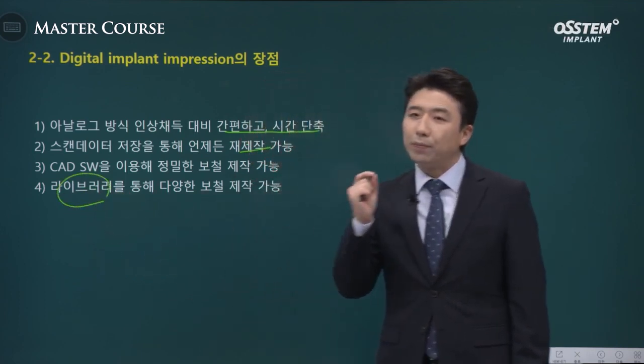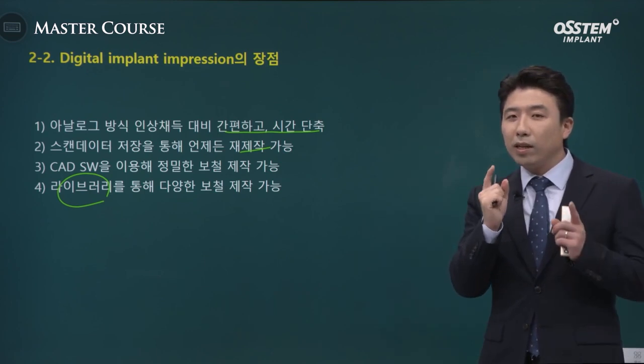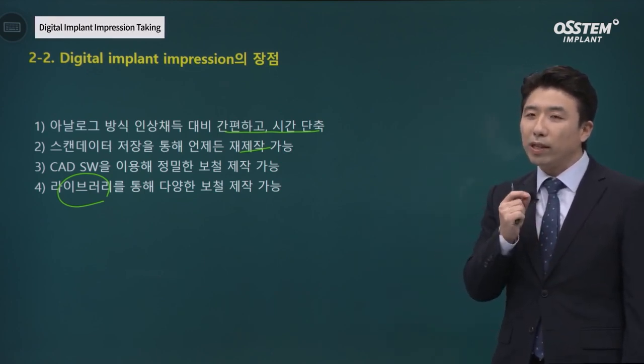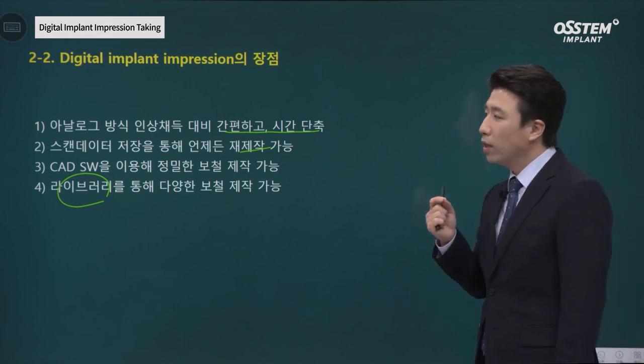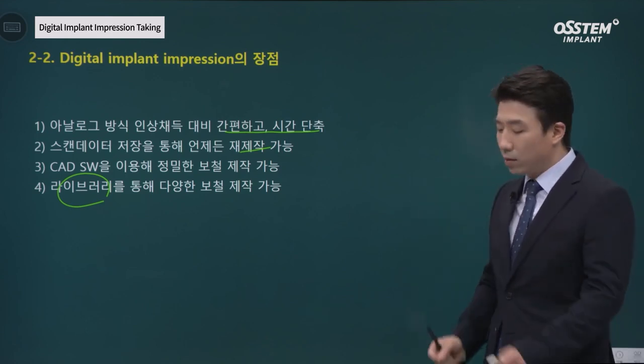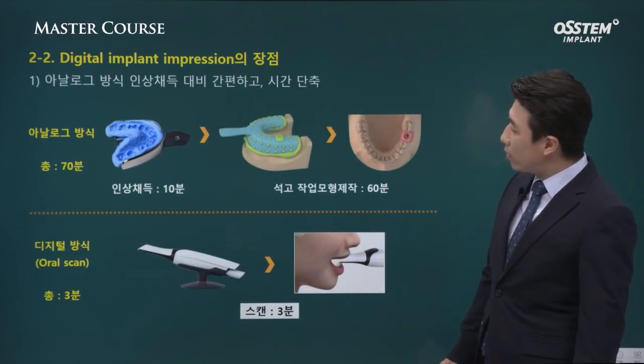The biggest advantage would be using a digital library. Implant components are included in the digital library, and they can be virtually used like real products, a great advantage.